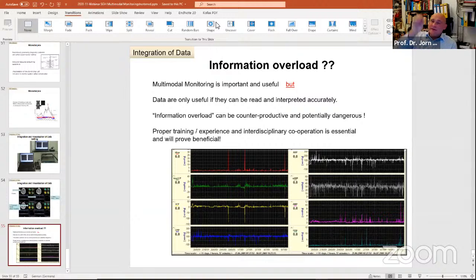If you put an ICP probe into a patient who has had a hemicraniectomy, some people do that, I don't know why, but I don't really do that. PO2, yes, but not ICP. I wouldn't put ICP into patients who had an operation, because you can't really use the readings. If the contusion is completely devastating and this side is lost but doesn't need to be operated, I would probably put it on the other side to prevent damage to that. But then I would include a PO2 probe as well. Did that answer your question?